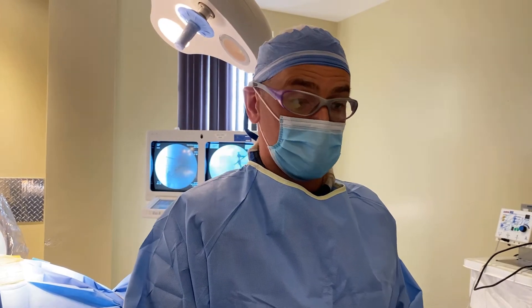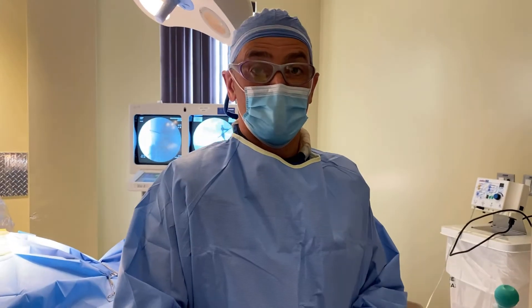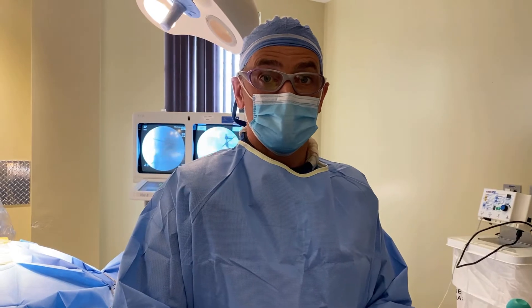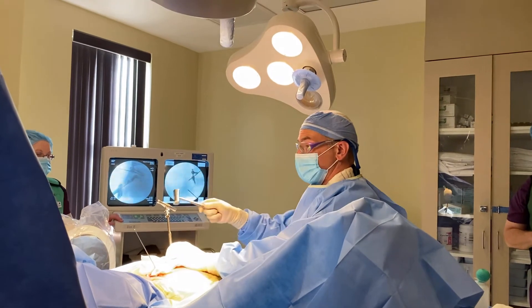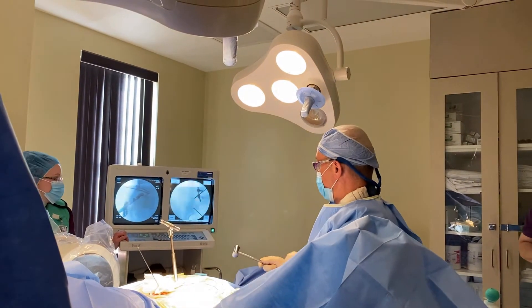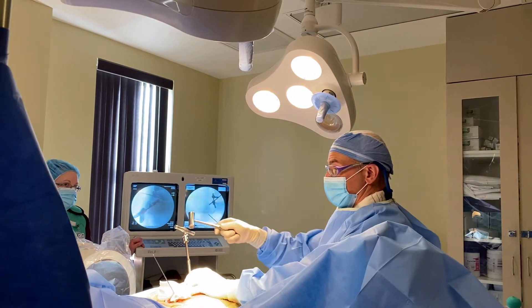It's a twofold treatment to stabilize the SI joint. Patients can get immediate relief with an 80% satisfaction rate reported. What we're doing now is tapping in the joint finder — there's a little bit of pressure. The patient is under light sedation and the joint is numbed up, so she'll feel a little bit of pressure, but that's basically it.